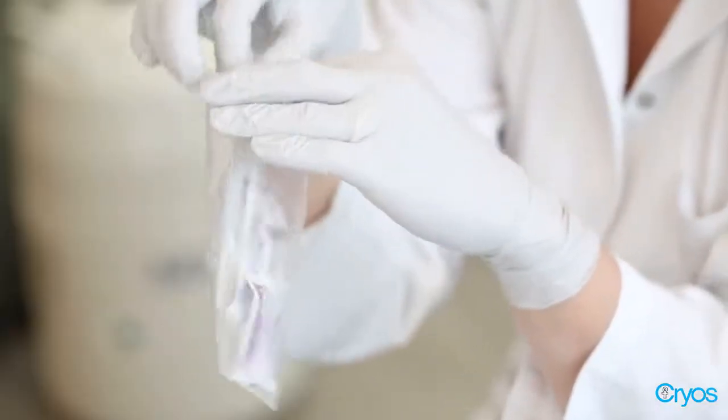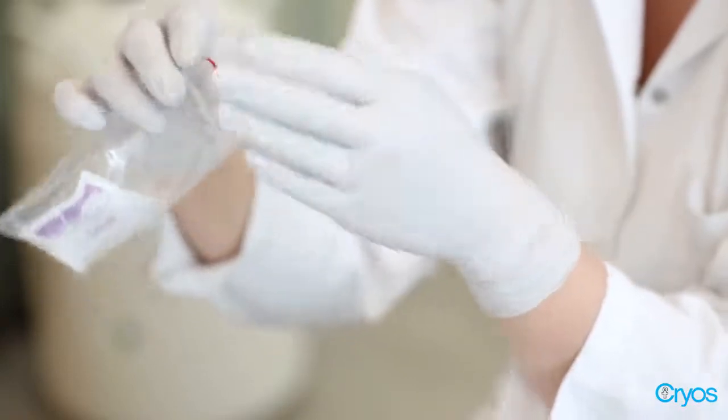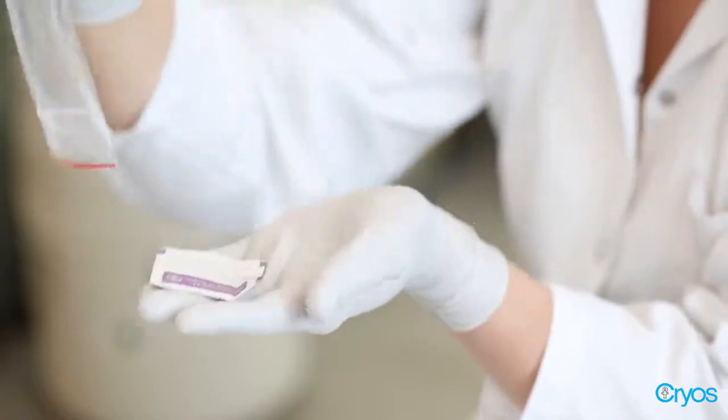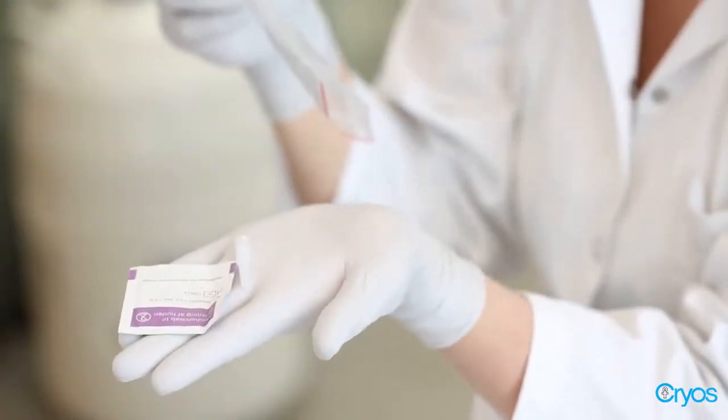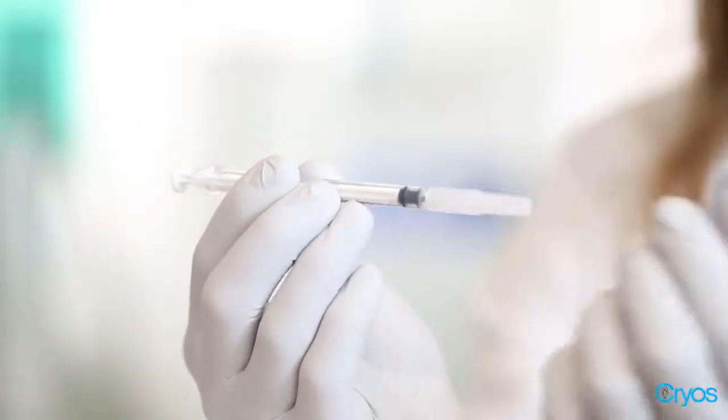The first step in home insemination is to remove the straw from the packaging and allow the straw to sit at room temperature for 15 to 20 minutes. This can be done by simply setting the straw on a clean surface. The kit also comes with an adapter, a syringe, and an alcohol pad. Fit the thick end of the adapter onto the end of the syringe.